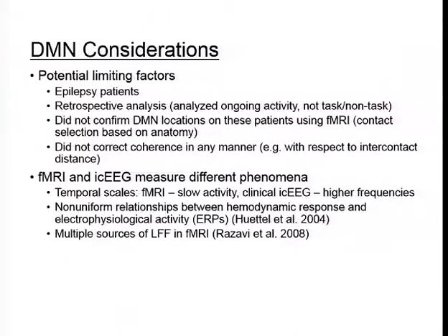Maybe we do not see any direct relationship between these different parts of the brain using EEG, but if we perform a functional direction-of-connectivity analysis, maybe we can see something in these regions. That's definitely possible and definitely something that should be studied, though it's not something we looked at here.